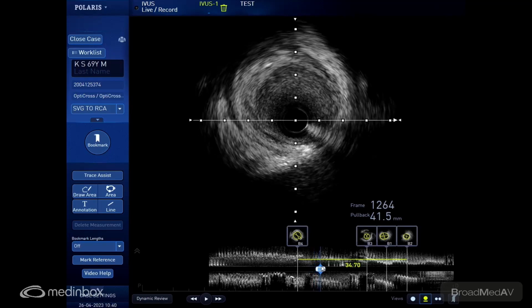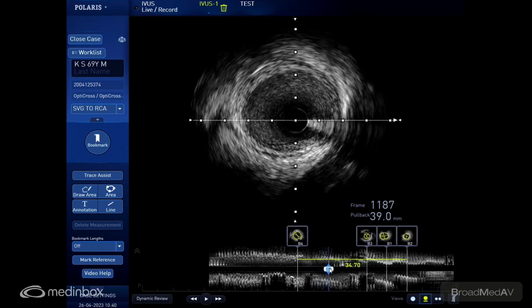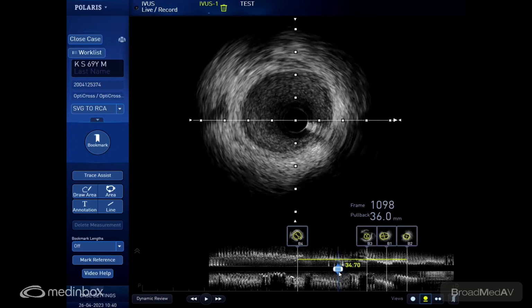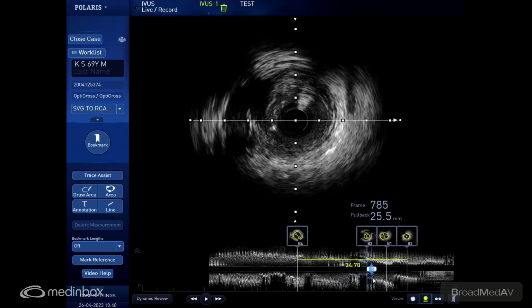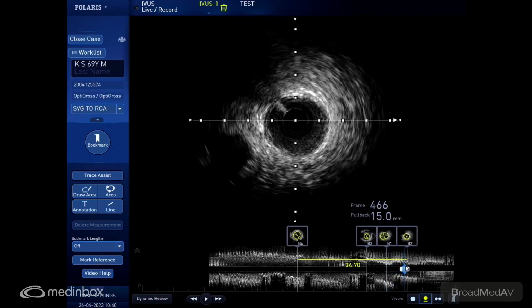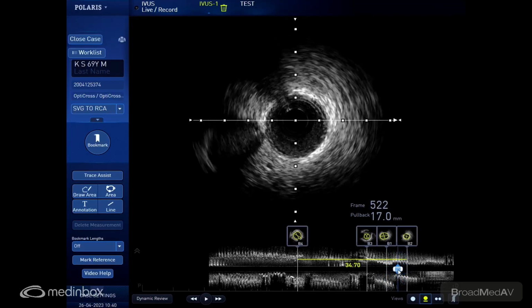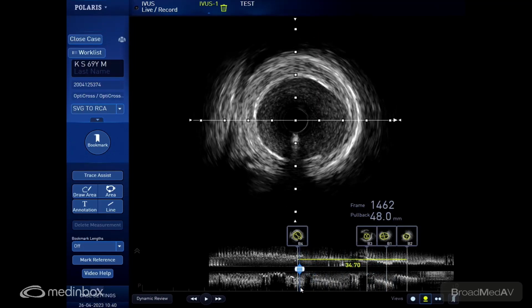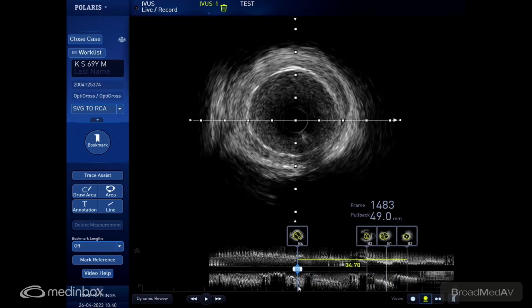So these are all diffusely diseased grafts, so it's better to address that. I need a stent which will go from 2.5 to 3.5, which is about at least 34, maybe 36. 34 should do because we have one or two here. Also, we have some space. So what stent do we have, Ganesh?